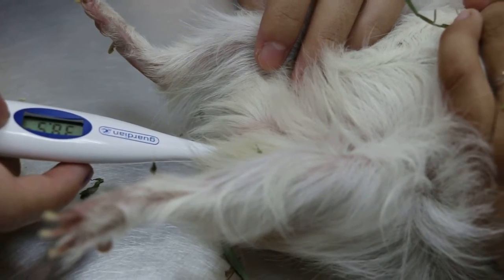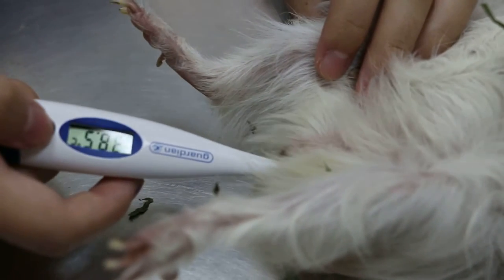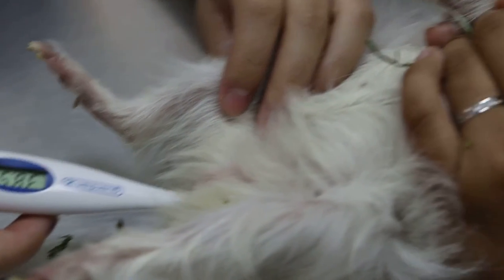We take a temperature of this skinny pig with a head tilt. The temperature is 38.5 — that's normal.